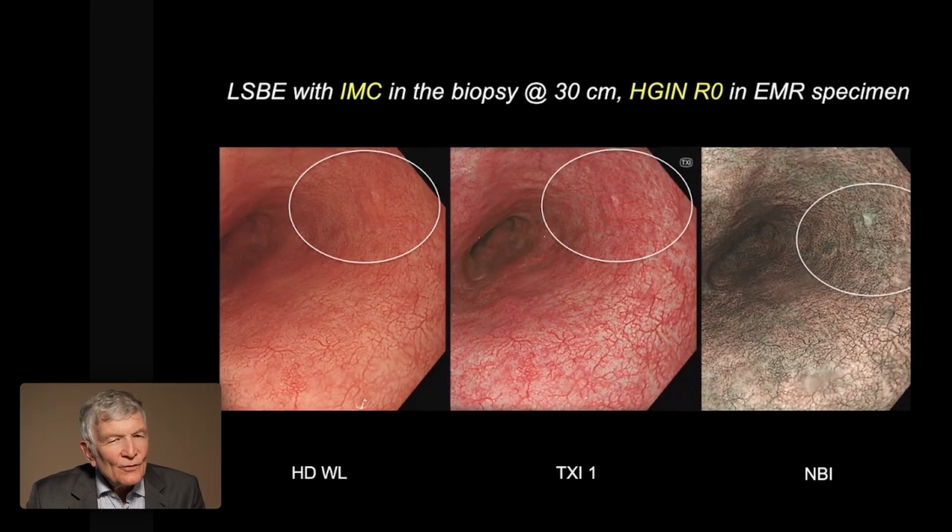On the other hand, in all fairness, we also have to say that methodologically we have a huge advantage. We get a case where we know there is something and we have to find it, whereas the poor colleague outside scopes hundreds and hundreds of patients and he has to detect the one among, I don't know, 200, 500, where something is wrong. So that's a totally different challenge, isn't it? We always have to congratulate the referring gastroenterologist for finding such small lesions in maybe 30 patients per day. This is really a challenge.